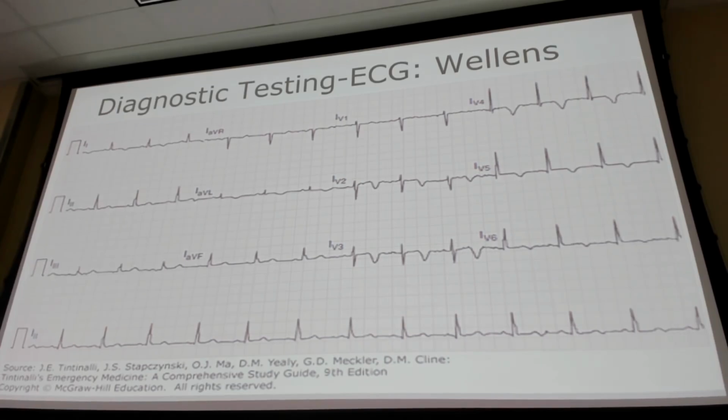So when you see this, this is somebody we don't want to send home. They're not having a STEMI right now, and their biomarkers are likely going to be normal. But we still need to think about this when we're evaluating it, and we should probably keep them in the hospital, consult our cardiologist. They'll decide whether they're going to do a cath or not, which they usually will do a cath. There are other criteria for this, but we won't get into it.